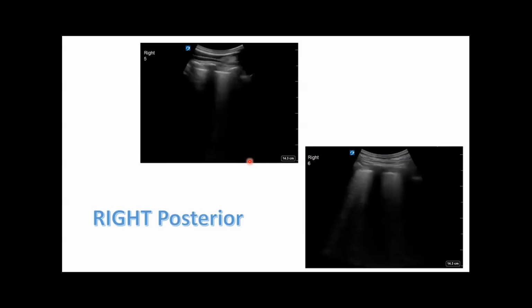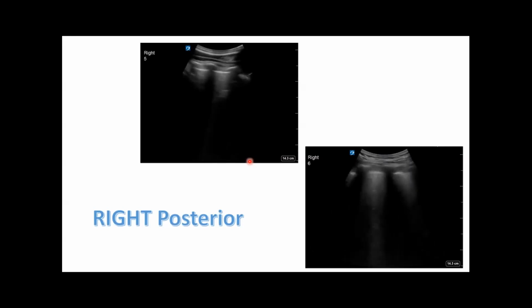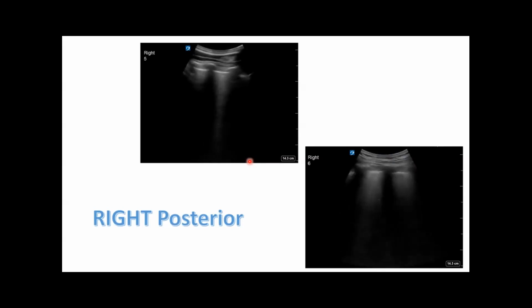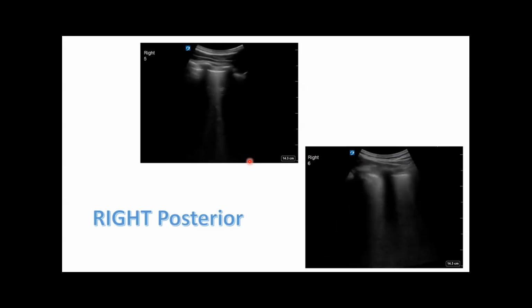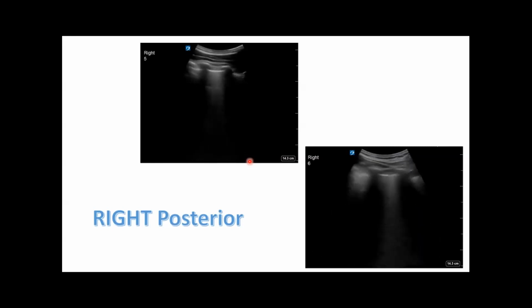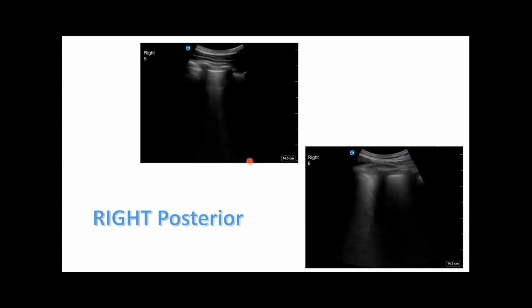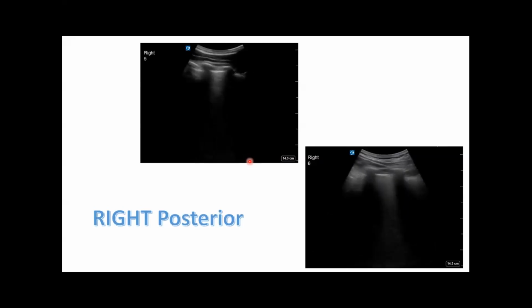Now, on the caveat, if you have a patient in heart failure or flash pulmonary edema, those patients have a lot of interstitial fluid in their lungs. So you're going to see B lines diffusely, very similarly to COVID. Typically, those patients, you won't see subpleural consolidations unless they also have pneumonia. And typically, you're not going to see these skip B lines because the whole lung is filled with fluid. As opposed to COVID pneumonia, you're having these focal patchy areas of consolidation where your B lines are stuck on that consolidated lung, and where it's not consolidated, you're seeing normal aeration. So that's one way that you can figure it out, but in reality, again, it's clinical context. Hopefully that answers your question.